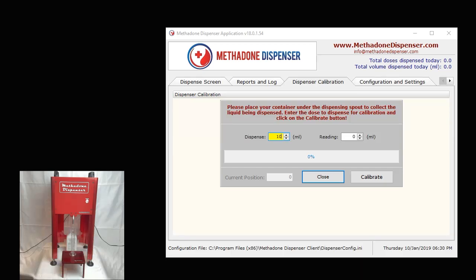And this could be the medication as well. When you click on calibrate, what the dispenser will do is dispense what it considers 10 ml. Once that process completes, when the dispenser completes dispensing, you need to capture the volume of liquid that has been dispensed in a measuring cylinder.